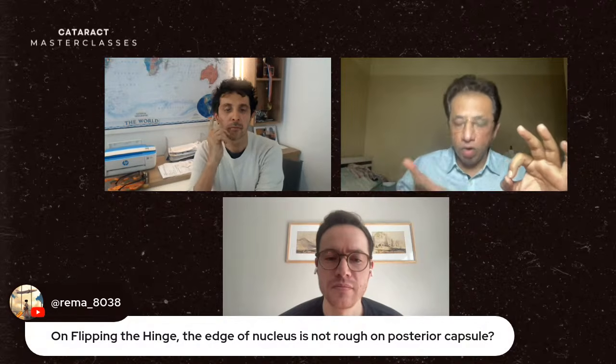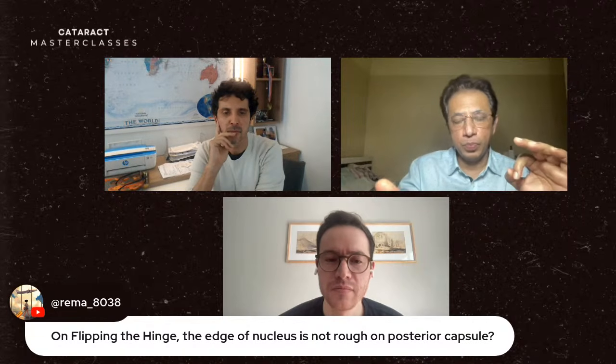Great. Yeah, because sometimes you push the nucleus when you're trying to form the trench, and that's kind of tricky because you're pushing downwards all the way back. Yeah. No, you shouldn't push downward. It's always angulated. There's no posterior. As I told you, when you're sculpting, remember that this is the whole of the phaco tip. Half of the tip has to be open always. If you keep this in mind, then what happens? You will not go posteriorly. You can always go like this in an angulation.